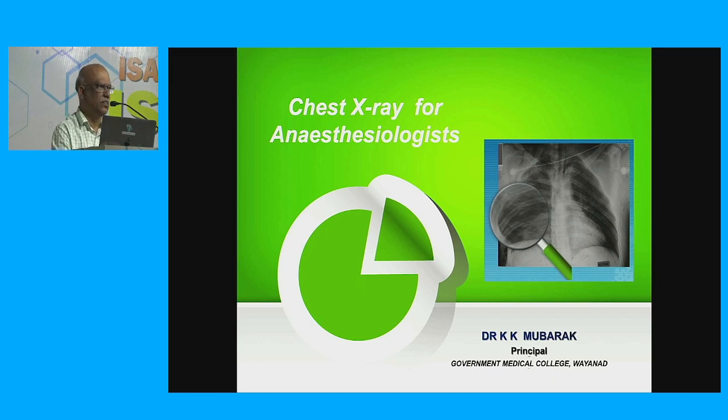What are the indications? So, what are common indications of chest X-ray in anesthesia and critical care practice? Can some of the postgraduates sitting behind also volunteer? Yeah, please, Anju. Anybody can, please. We'll not waste much time.